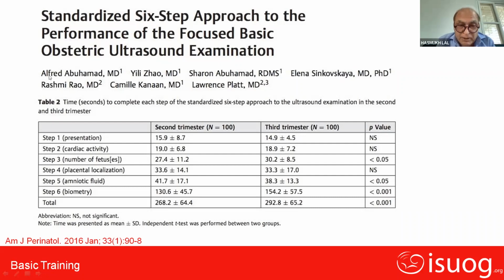This is in seconds. So if you follow a protocol, see how few seconds it takes to complete some steps. Some steps will take time, like biometry, which would be a little challenging, and the number of fetuses sometimes, but still it is not very high. Biometry is the longest here, 130 seconds in the second trimester, and in the third trimester it is 154.